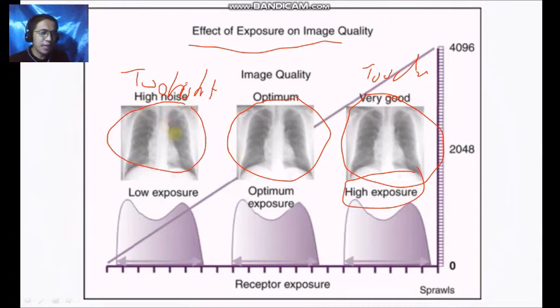So even if the image that you have taken from the patient was too bright or too dark, again, the computer will automatically rescale, automatically adjust the contrast and density based on the exposure that you have set on the monitor or on the computed radiography system. Like for example, in the chest examination, the factor used was for an abdominal examination, so the factor was too high. Okay?